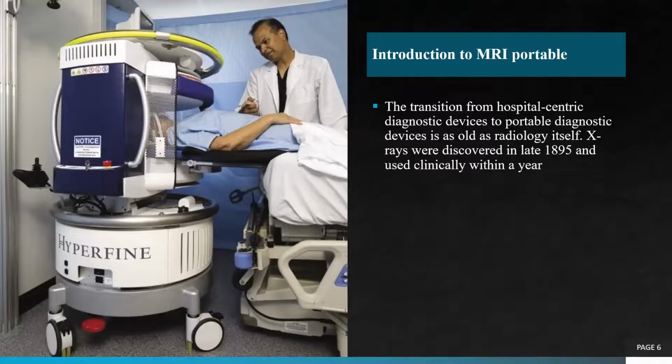Compared to this, 45 years after the introduction of MRI, we still lack a truly portable MRI machine. Here we define portable as a device that can be moved from room to room by a single nurse for use on an individual patient within minutes of arrival. This contrasts with currently mobile MRI inside trucks or trailers that require dedicated power and cooling infrastructure, with waiting at the new location and at least a couple of hours of preparation before scanning. Note that there are also solutions between traditional and truly portable, where some special infrastructure is provided in the room.